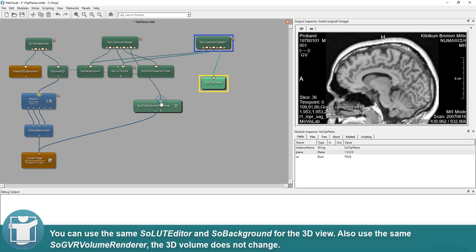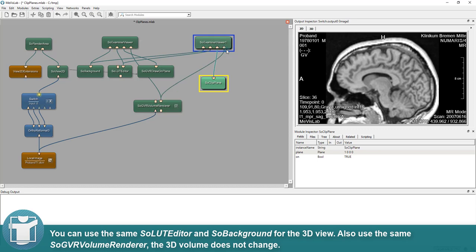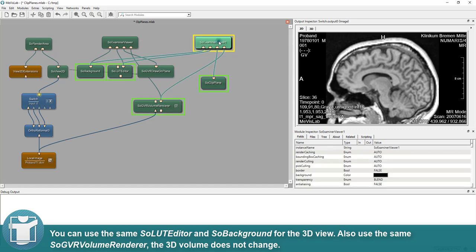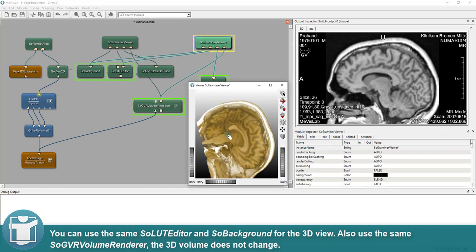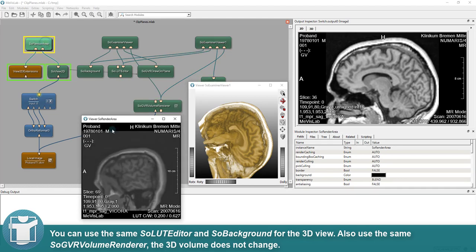You can use the same SO LUT Editor and SO Background for the 3D view. Also use the same SO GVR Volume Renderer, the 3D volume does not change.